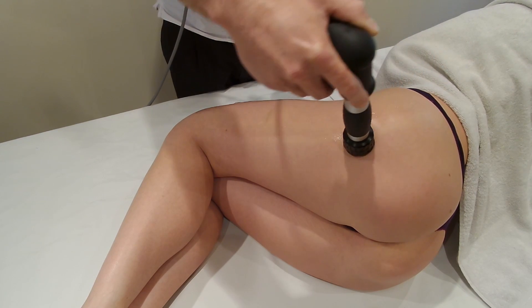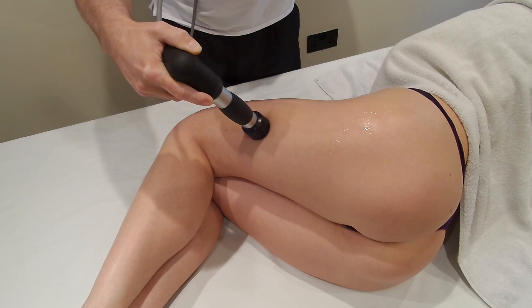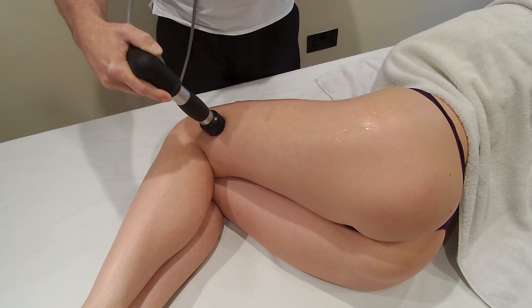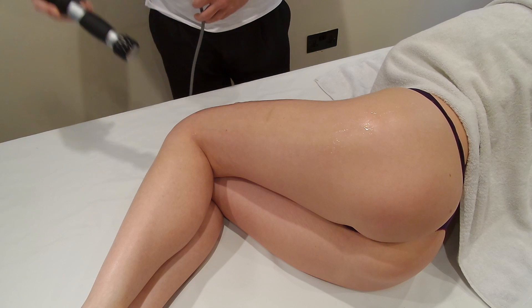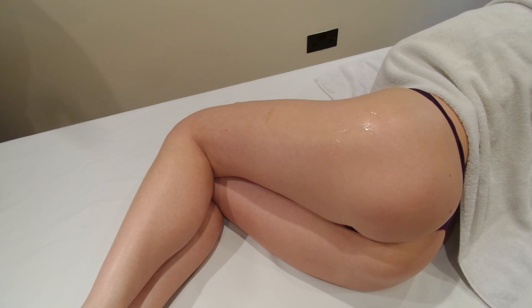You don't have to do the treatment in this position. You could put the iliotibial band under stretch by dropping the knee off the edge of the treatment couch and straightening the knee, which will put it under more pressure. We've now run to the end of a thousand shots — we're not going to do all three thousand on this leg.